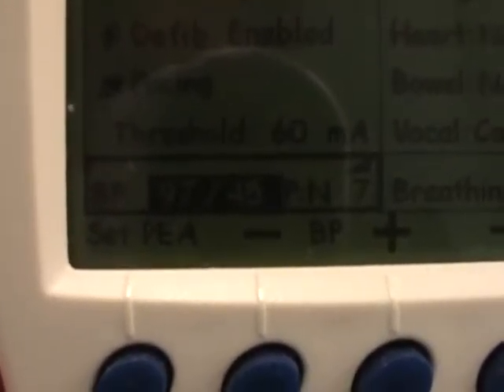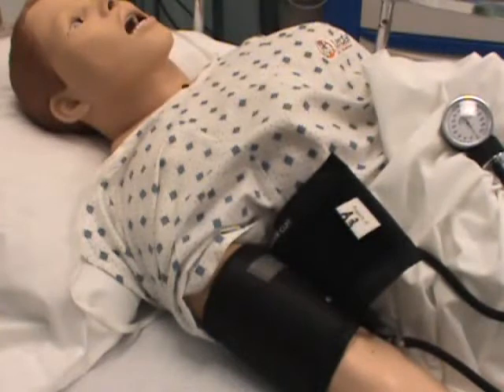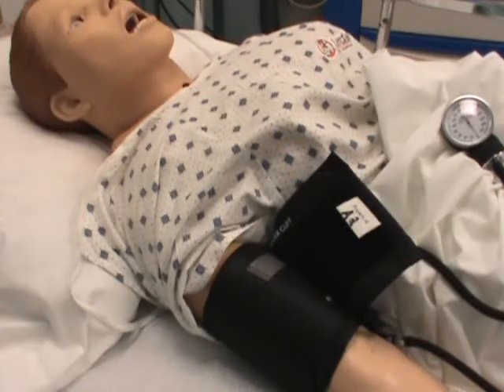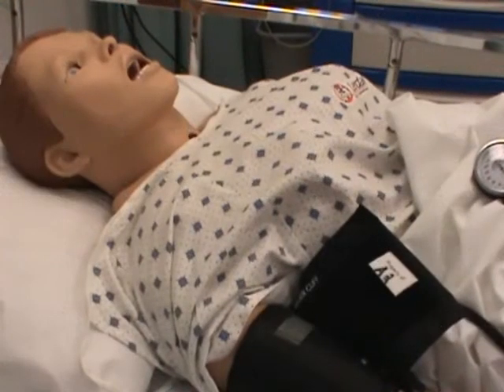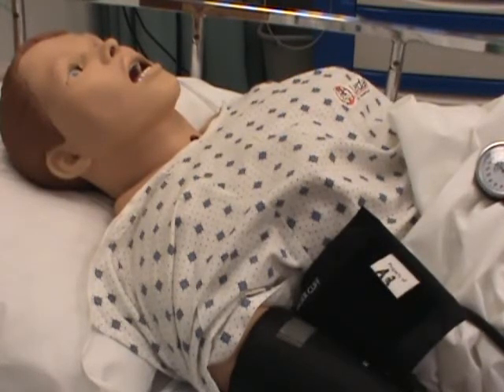And that's how you change your blood pressure. That concludes the blood pressure demonstration for the VitalSims mannequin. Once you have the blood pressure set to where you want it, your students will take readings just as though they were taking blood pressures on a patient — they will inflate the cuff, landmark their stethoscope, and listen for the blood pressure.